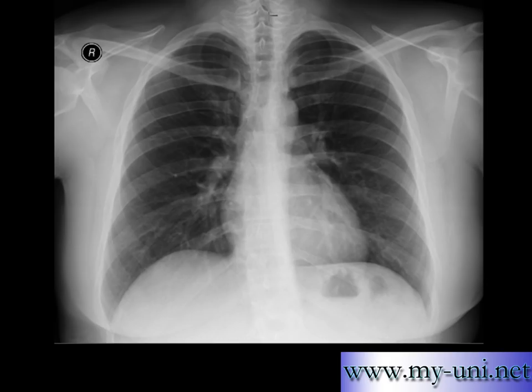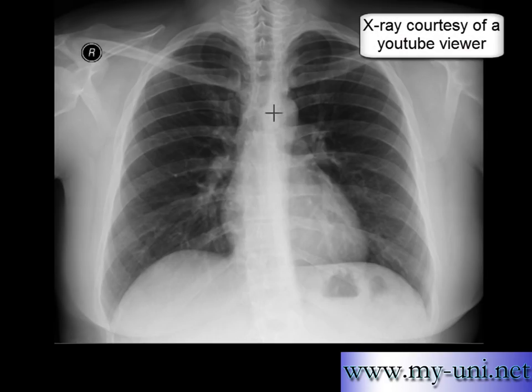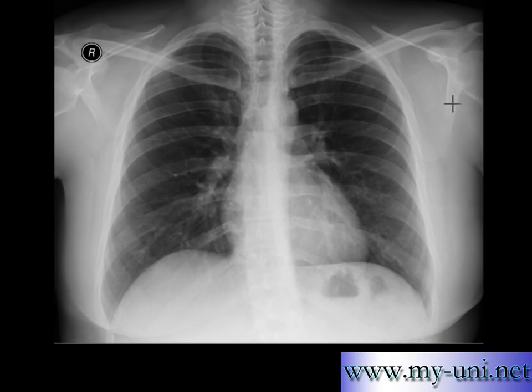How to measure cardiothoracic ratio — this is something very important for a physician to know. This is one of the basic tools to comment on cardiac size, whether the heart is enlarged in a particular person or not. Something very simple: make sure you have a PA view. Traditionally, you don't measure cardiothoracic ratio on an AP view, or if the x-ray was taken in supine position. Anyway, we have a PA (posterior-anterior) view.